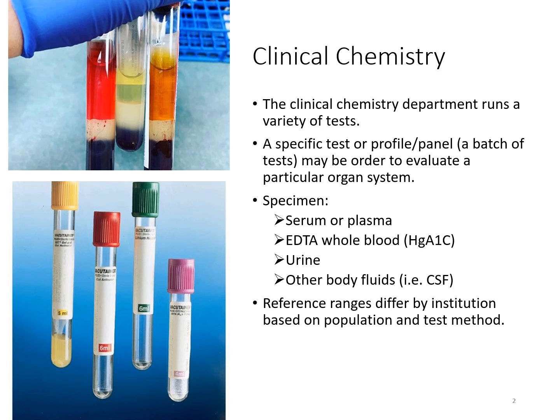Your specimens are typically going to be serum or plasma, and with serum or plasma, you're usually going to draw your sample in just a red tube for your serum, or it could be a serum separator tube, which you can see a picture of over here to the side. Your red tube here would just be serum, and then your serum separator tube is this gold tube. Some people may still refer to this as a tiger top. What it has in it is this gel at the bottom. This gel will create a barrier once it's spun down.